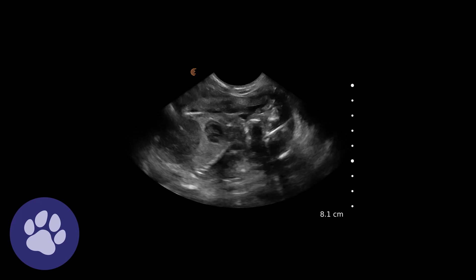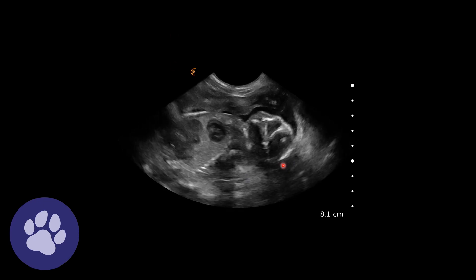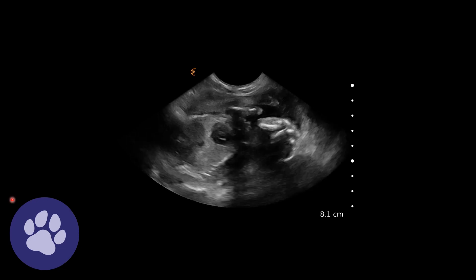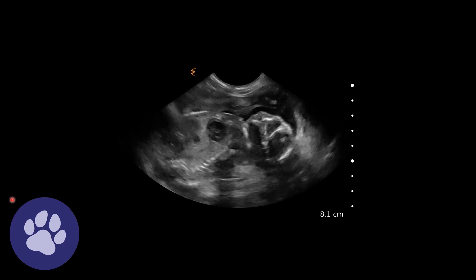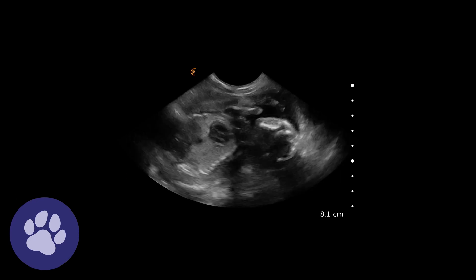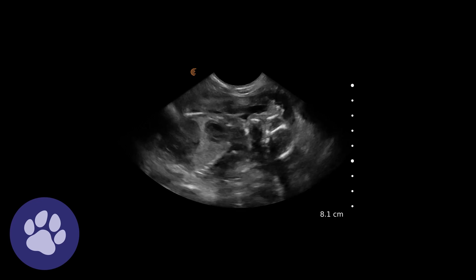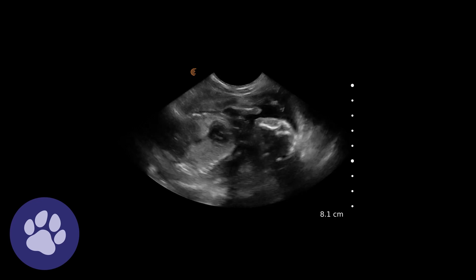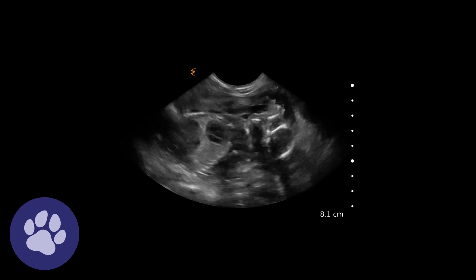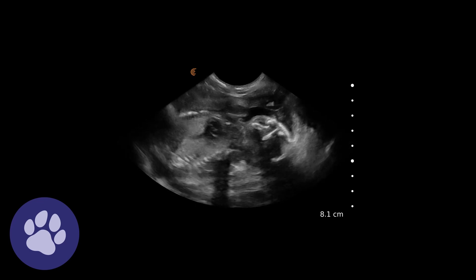Here we can see the fetus again — the heart beating and the abdominal contents. One of the things that tells us this fetus is not ready to be born is because we can't see any wall layering in the intestines. That comes very, very late in pregnancy. If we can't see that wall layering, we are not near enough to perform a caesarean.